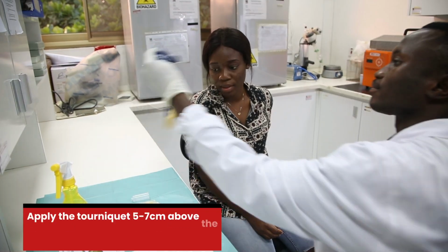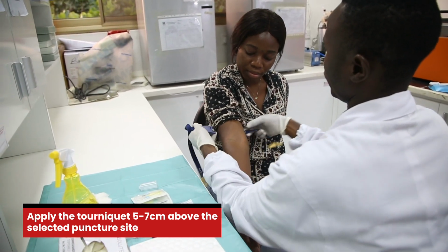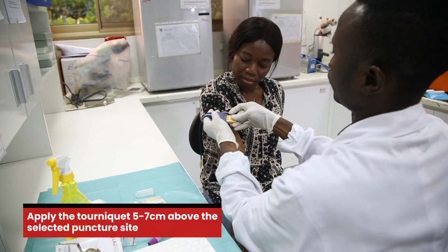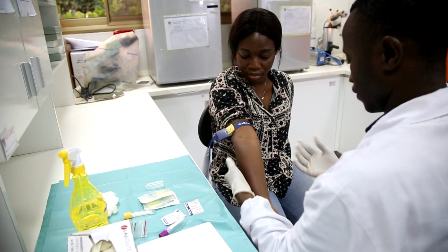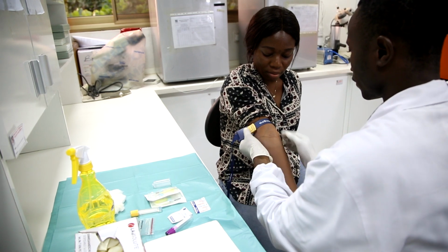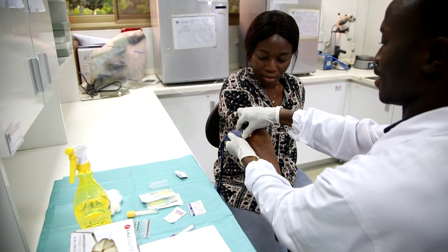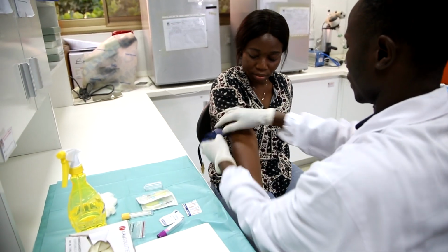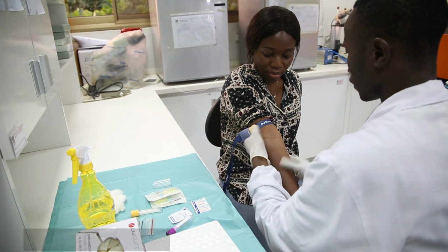Apply the tourniquet 5 to 7 centimeters above the selected puncture site. Do not place it too tightly or leave it on for more than 1 minute. If the tourniquet stays on longer than required, release it and wait about 2 minutes before reapplying the tourniquet. The patient should make a fist without pumping the hand to make the vein more prominent.